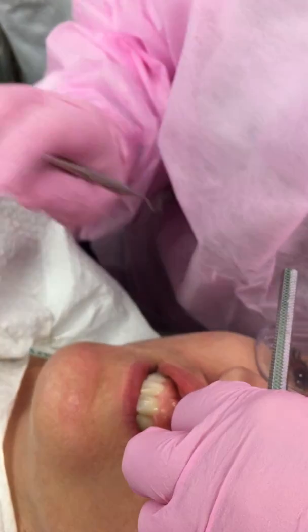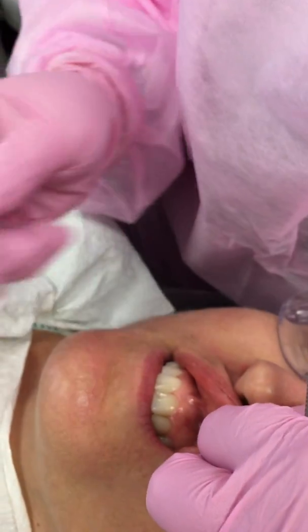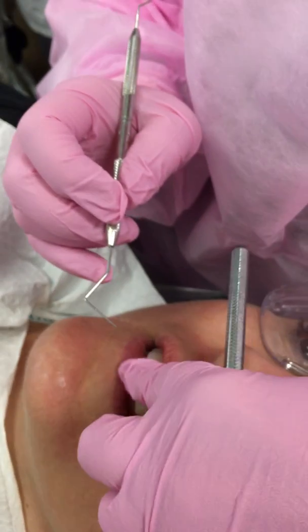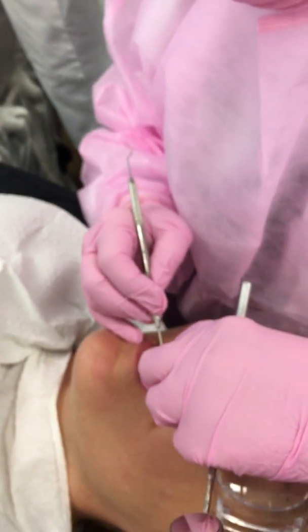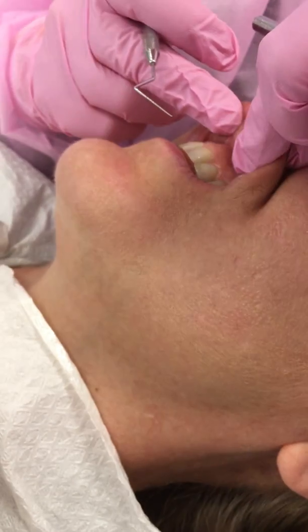Okay, so that dark line is the mucogingival junction, and then anything that's apical to that is the alveolar mucosa. And then up in here is the vestibule, and then here we have the labial mucosa. See that? Inside of the lip. All right, same thing on the lower.